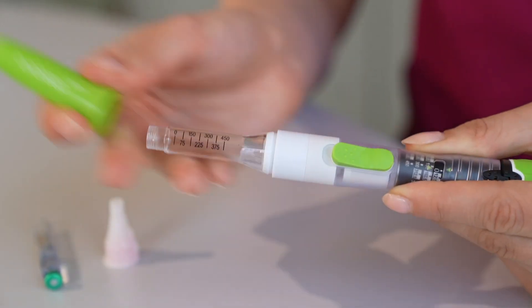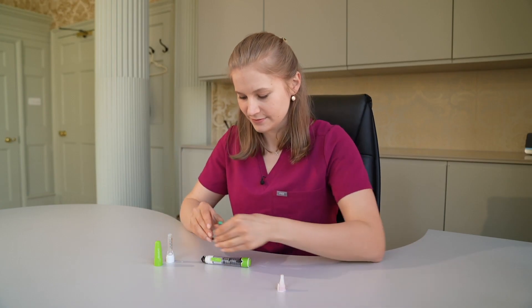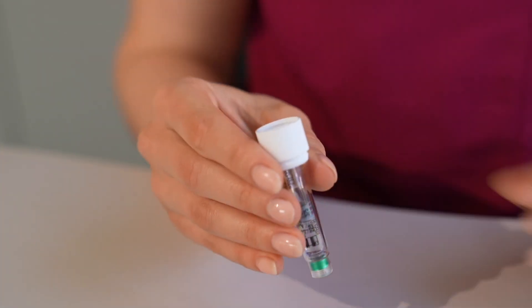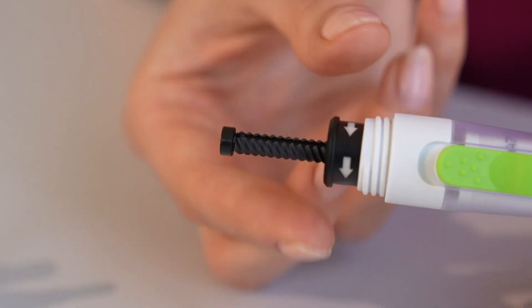Remove the green cap from the pen device and unscrew the empty chamber. Place the vial of medication with the colour cap facing downwards into the end of the chamber. Take the other piece of the pen device and twist the black end in the opposite direction of the arrows until it can't twist anymore.